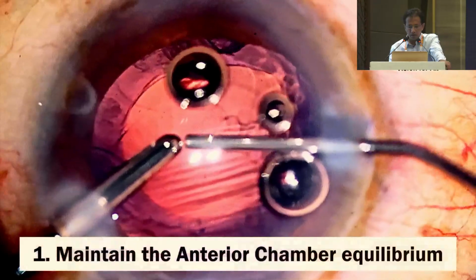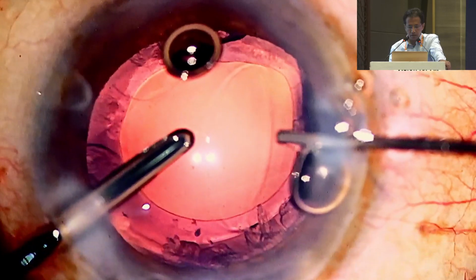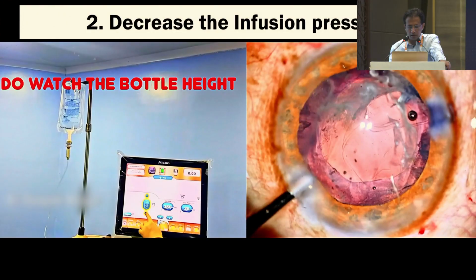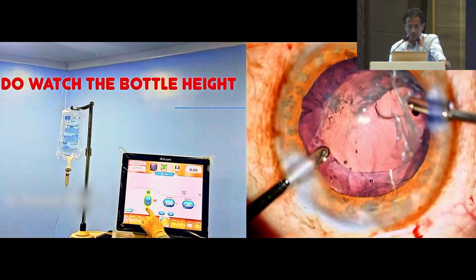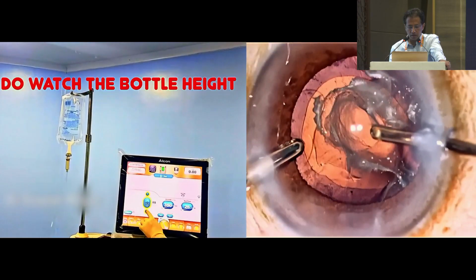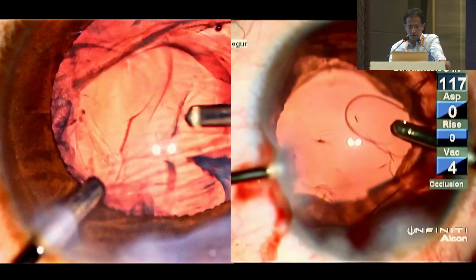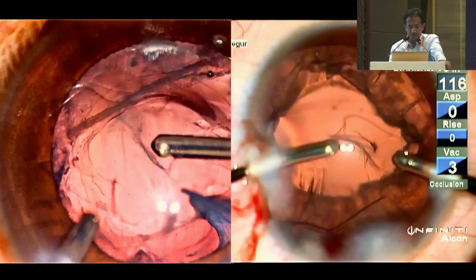Number one would be to maintain the anterior chamber equilibrium at every step. We already know this. We put in dispersive OVD before removing the irrigation to prevent its shallowing. Number two would be to decrease the infusion pressure as we begin the anterior vitrectomy. We need to reduce the bottle height since the chamber is already filled with dispersive OVD. Any sudden rise in the infusion pressure inside the eye with an open posterior capsule is one of the most common reasons why the posterior capsule tear enlarges during anterior vitrectomy.